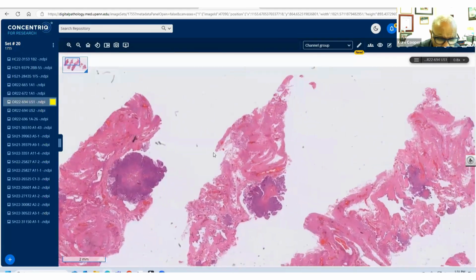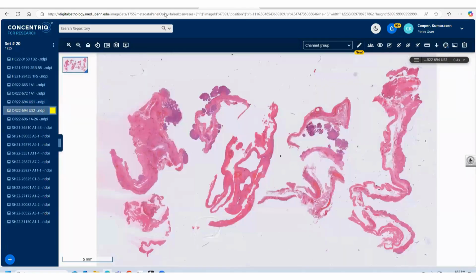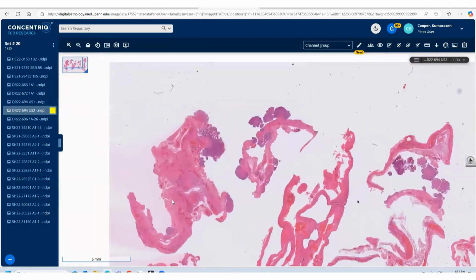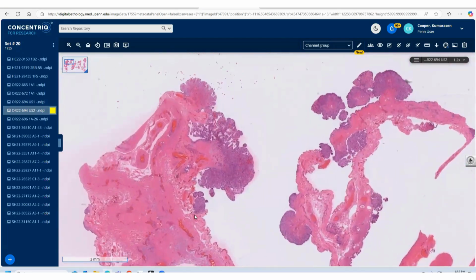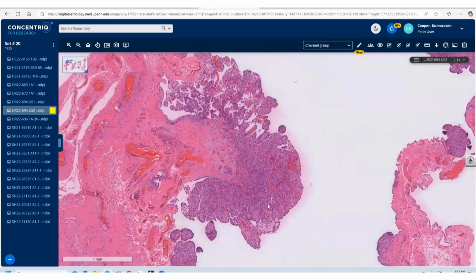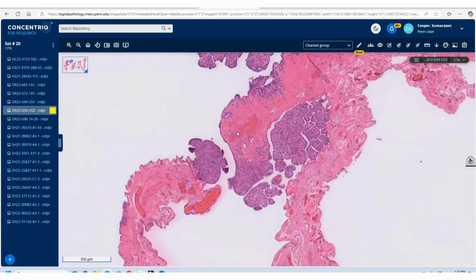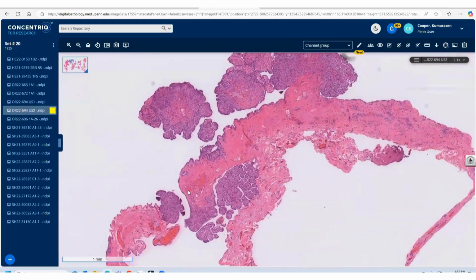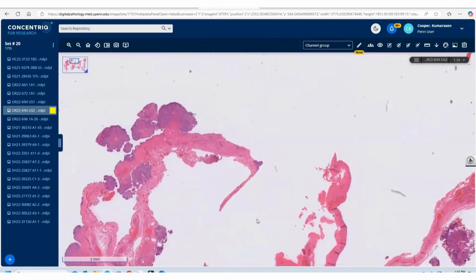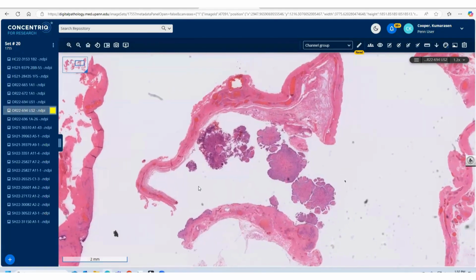Does anybody have MTAP with them? And if they could comment and tell us how it works. We do. You guys got everything in Texas, don't you? Well, I have to say, I've validated a couple different stains over the past year, but MTAP was here before I got here because my colleague validated it. You have to be careful. It's a little tricky. We have a new antibody now that's actually quite good and easy to interpret, but the one that we had before was very weak. But when it's lost, it's lost. It's pretty negative.